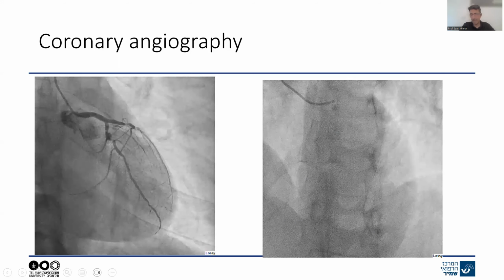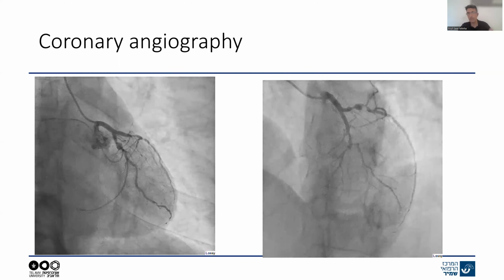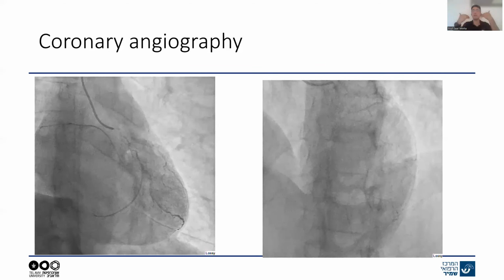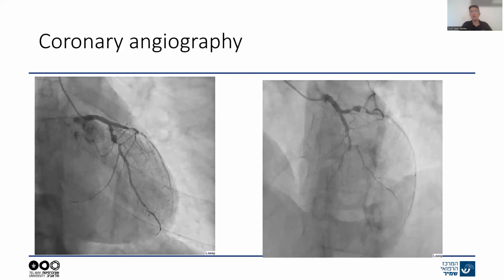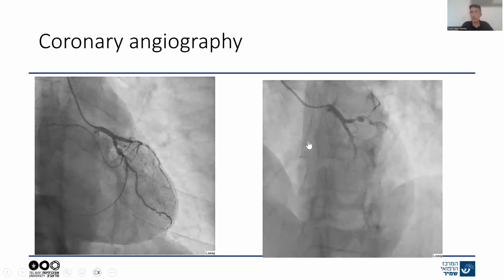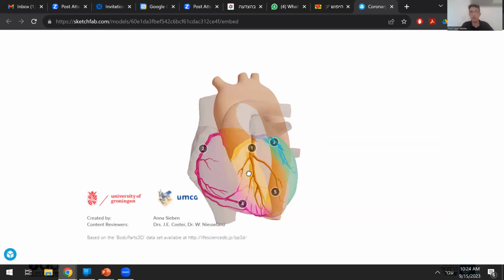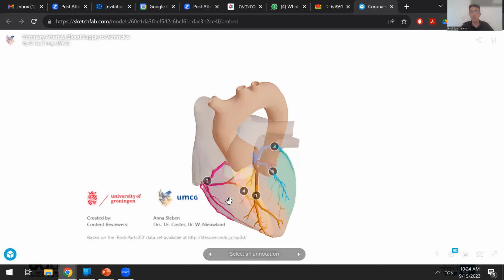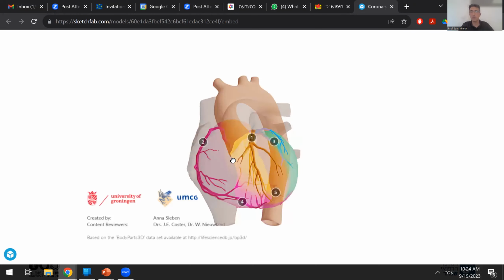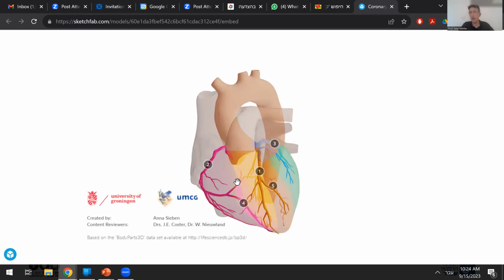Cool. The end game is this image. This is a live image, of course recorded, but this is what we see as operators live in our lab. You can see the heart beating on the right-hand side, and on the left-hand side, you can see different projections. Because as we said earlier, if we want to demonstrate this vessel, number 1 here, as a long vessel, we need to tilt the patient downwards and start turning it. And we still need to cover how we do that in our cath lab.